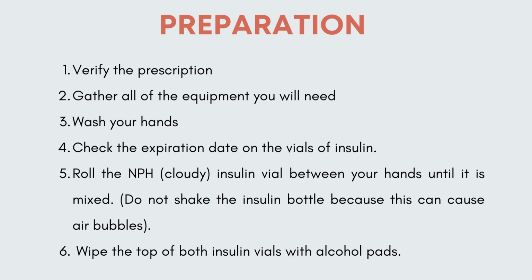You want to gather your equipment to do this. So, of course, you need those two insulins, the regular and the NPH. Make sure you check the expiration date. Make sure that's exactly what you have. You need to wash your hands. Again, check the expiration date because they could be expired, right?